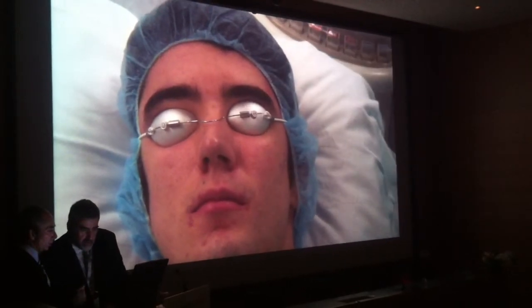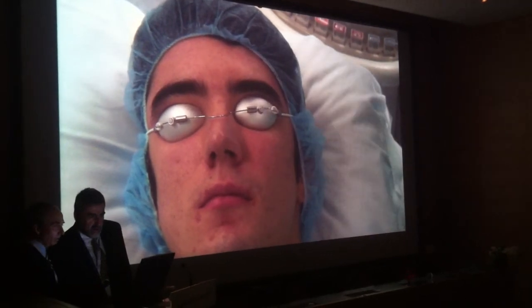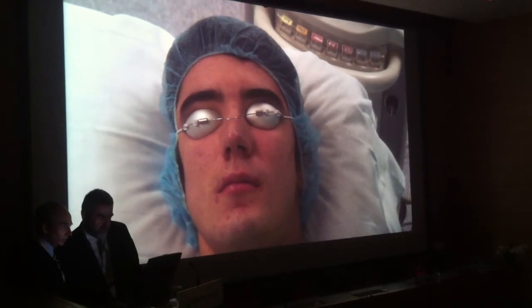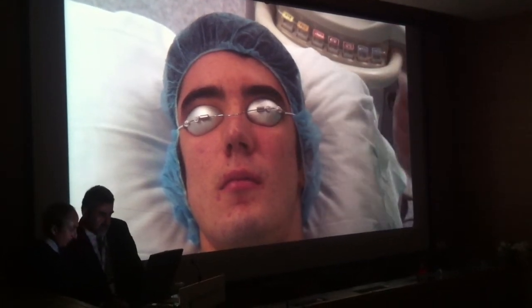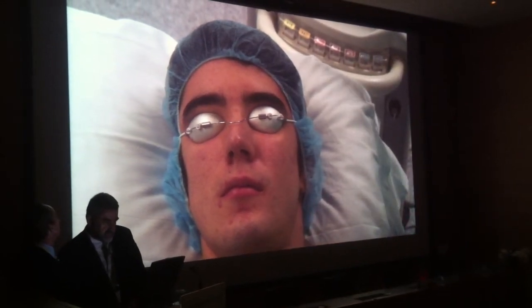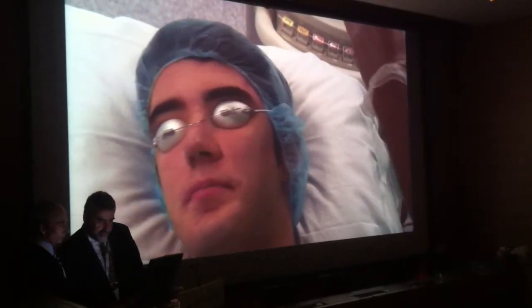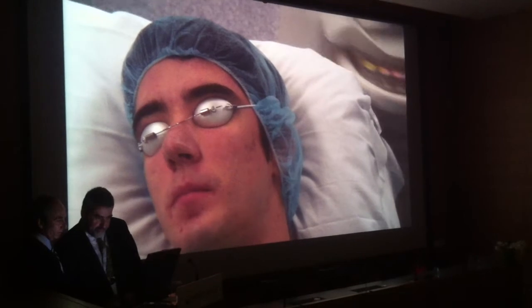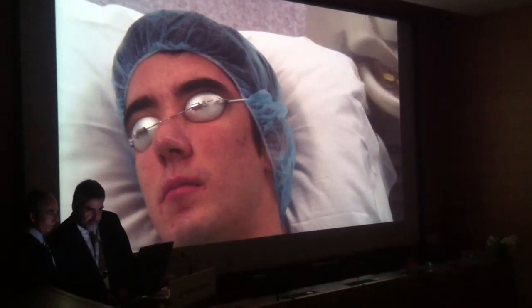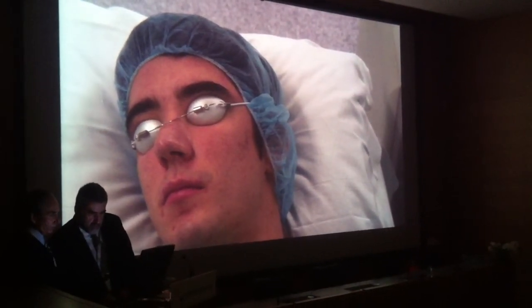My personal opinion is that you should wait at least 1 year to see the result of good collagen remodeling before proposing further treatments. I'm wearing my safety goggles, since we couldn't find ours. Probably someone fell in love with them, so I have to publicly thank Photona for lending me their erbium YAG protective goggles. And so basically, we're going to start now. What I want to underline here is that this patient has no anesthesia of any kind.